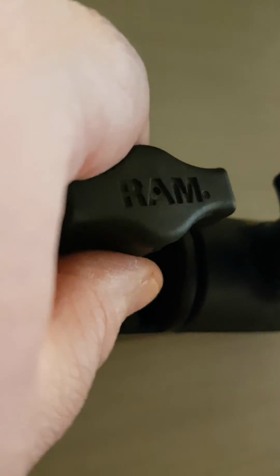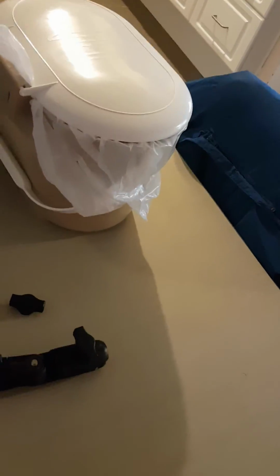Then I screwed it on, but not all the way, maybe about 6 turns, because you don't want it screwed down all the way or it's not going to swivel. So you turn it about 6 or 7 turns so that you've still got play. Here's my clamp. Here's my swivel joint. It's got play, it can move up and down, so if you're going on a slope, the cane still has play to move up or down, and it swivels back and forth. So that's how I did it.